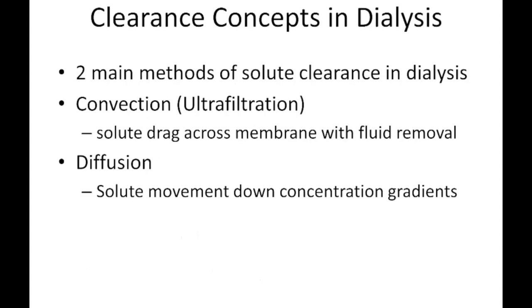So one of the first things before you dive into continuous therapies is to understand, to be very simplistic about it, how blood is cleaned. How do we produce change in the solute concentration and remove that group of toxins we associate with uremia. And there's 2 fundamental concepts. Terminology here, I have two ways to say the same thing. Convection, or so-called convective clearance, is very similar to saying ultrafiltration, basically removing filtrate of blood, skimming off the plasma water using a pressure gradient.